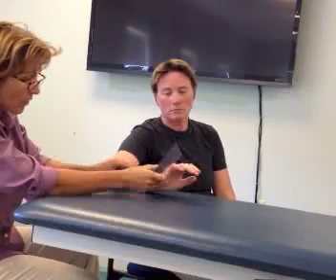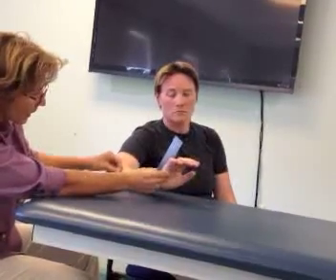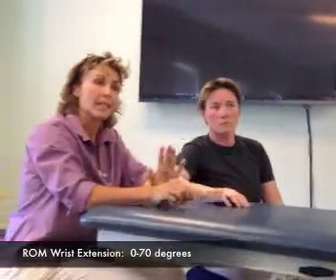So we're here, we're there, and I'm going right along all the way up the ulna to the olecranon here. And I can just bring her back — and I'm at 70 right there. So that's wrist extension.